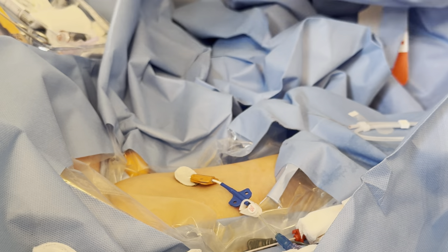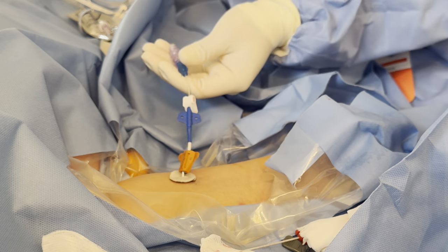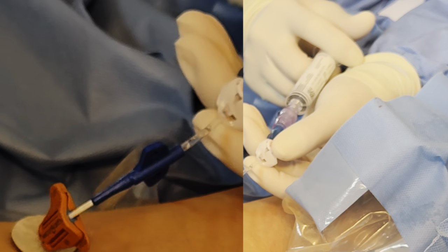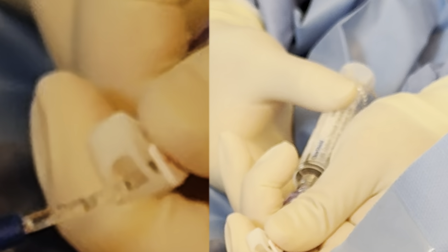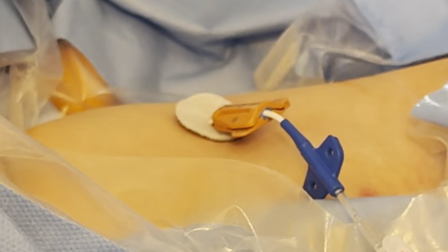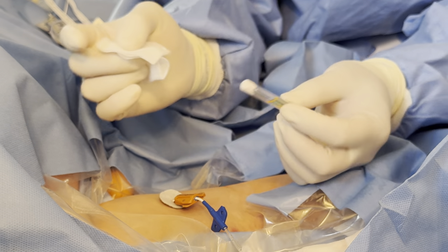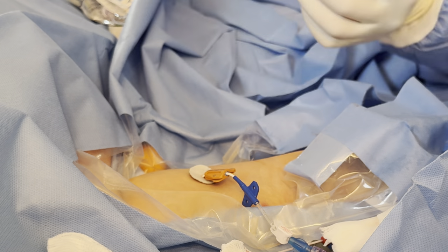Now we're going to apply the dressing. The patient is planning on having this for more than seven days of dwell, so I'm going to use Mastisol to help maintain integrity of the dressing. Great blood return, nice flush, no pain. I'm going to show you something interesting — you guys see those small bubbles in the tubing? Watch what happens when I remove this — did it move in and out? That's the key. I'll show you why these TKOs are so important. If you don't understand why it matters that those bubbles didn't move, you're not going to understand why these lines are clotting — and we'll show you that later.